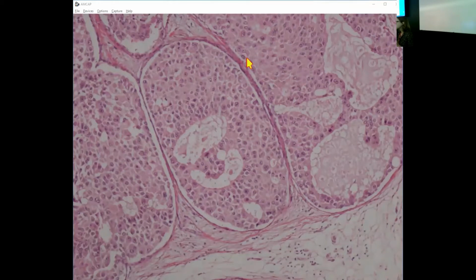I think the other time I struggle is with atypical apocrine adenosis. When is it just atypical apocrine adenosis versus atypical apocrine DCIS, versus apocrine DCIS involving adenosis? Again, I would look around the rest of the specimen to see if there are other areas that I can call DCIS. Is there DCIS elsewhere that looks similar to what's involving the adenosis? That's sort of my management approach there.